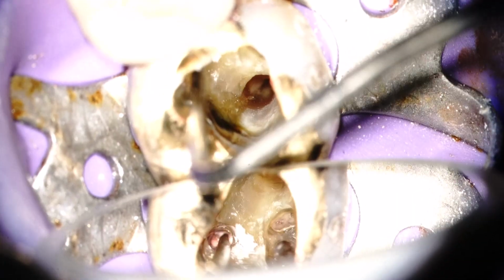Here's the touch and heat applied again for 3 seconds, and I go back now with the number 8 plugger, pushing the excess gutta-percha off the walls down onto the pad and compressing.